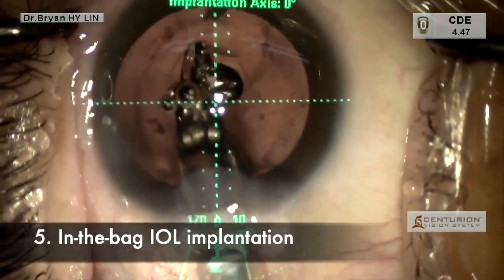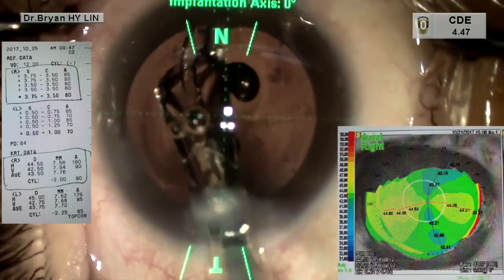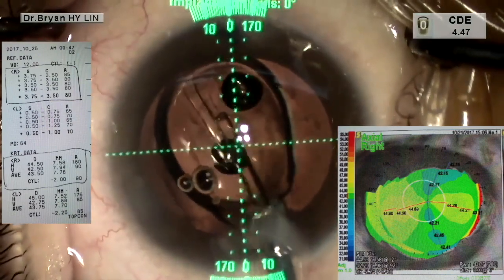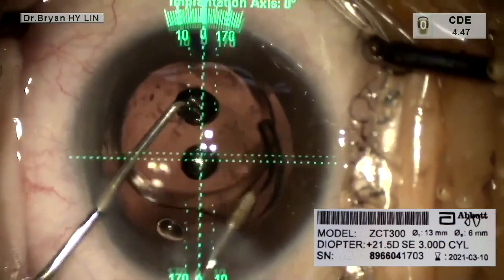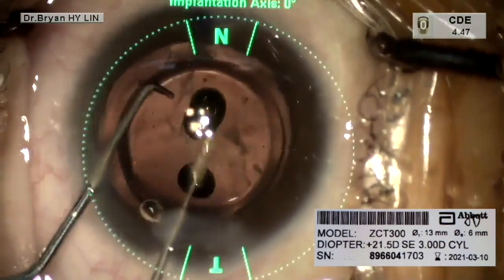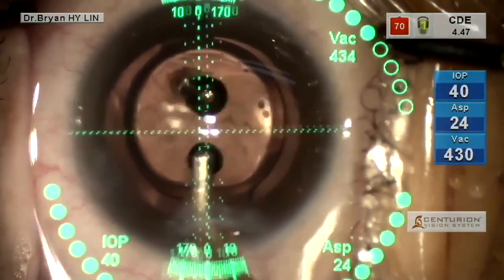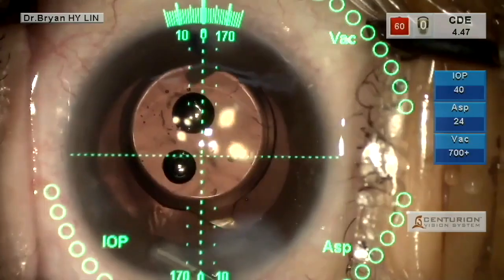Now we can apply this chart to this case. The patient has corneal astigmatism around -2 diopter. Since the posterior capsule hole is small, the zonule is intact, and the CCC is central and complete, I placed a toric IOL in the capsular bag. Rotate the toric lens to be aligned with the steep axis. Avoid downward pushing force toward the capsule. Place the IA tip on the anterior optic of the IOL to remove as much viscoelastic as we can. Close the wound with hydration.